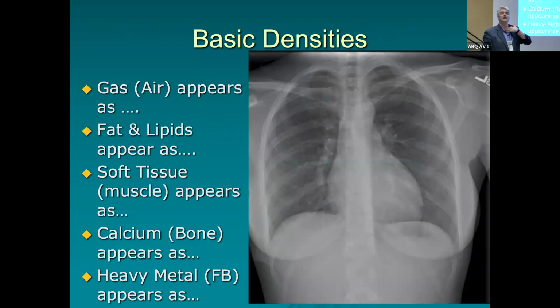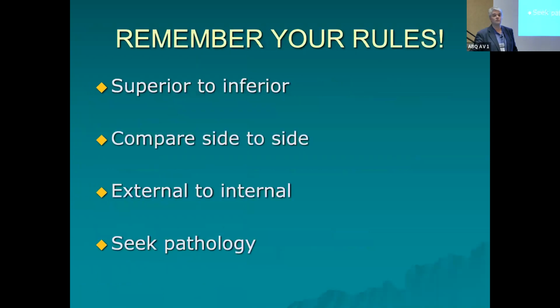Well, this kid was having a hard time breathing, having a hard time choking, and he was looking for a pneumonia, saw no pneumonia, pulled it off and sent the kid home. Kid died overnight because up in here was a thumbtack that the kid swallowed. So when you get an x-ray, know that you are responsible for the entire x-ray. That's why I say have a reason or a rationale as to why you're getting that x-ray.